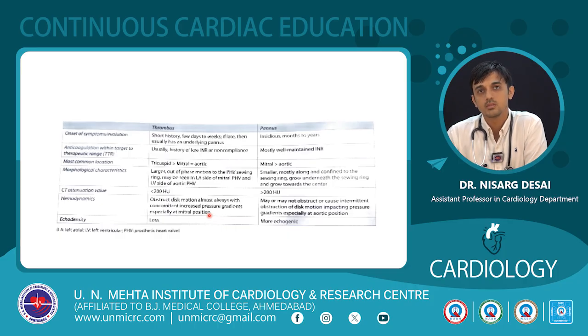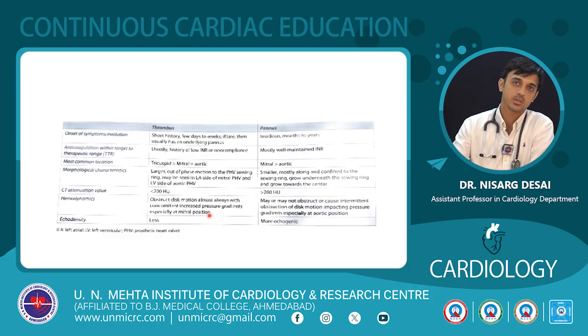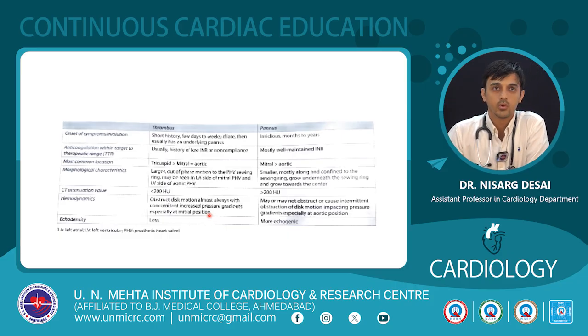commonly pannus is on the mitral. Mitral prosthetic valves are more commonly involved than the aortic valves. Thrombus will have history of non-compliance of drug, low therapeutic INR, whereas pannus usually has a long history, well maintained INR, and the patient will have no acute symptoms usually.